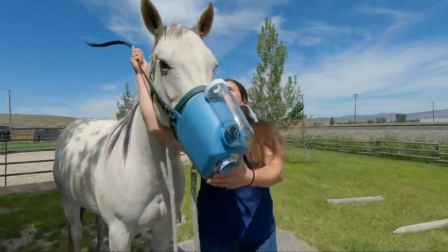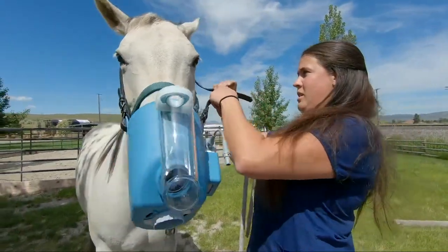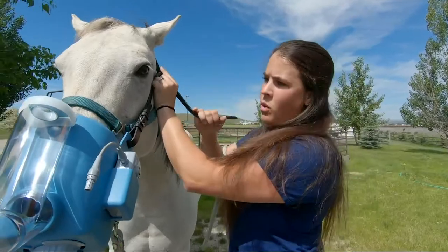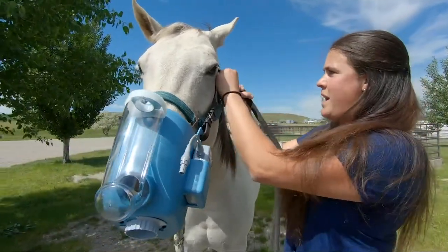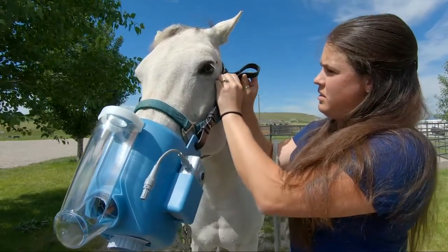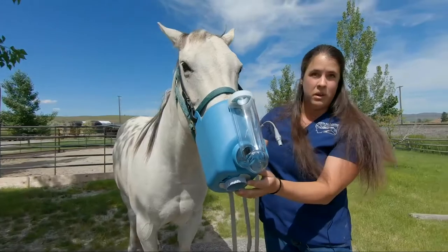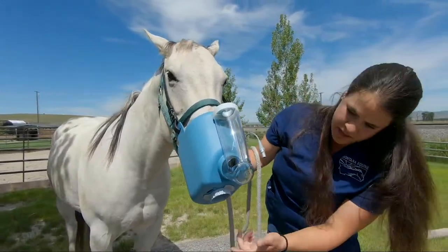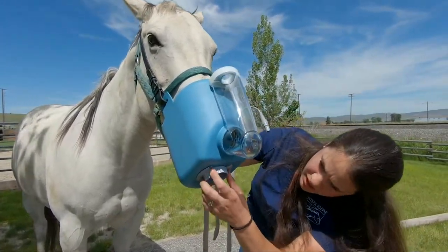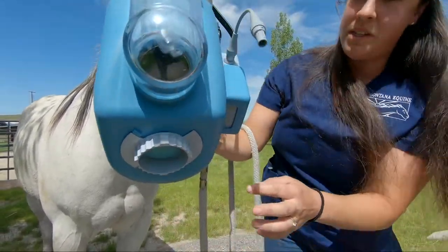And then you will strap it on. Good girl. You want it pretty snug — you want it to be airtight. So you'll have it on with the dial open for a bit. The next thing you'll do is close it so that there is no air whatsoever.